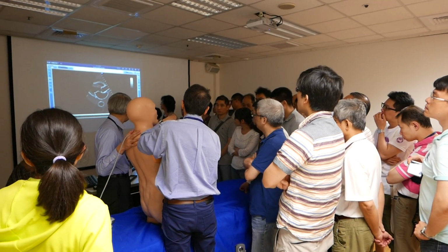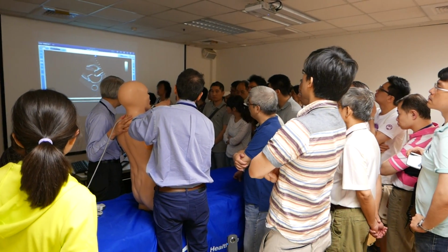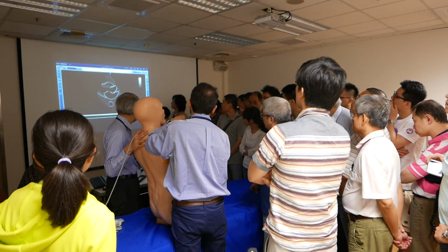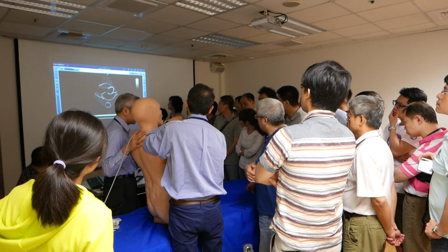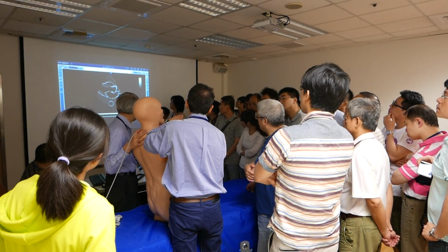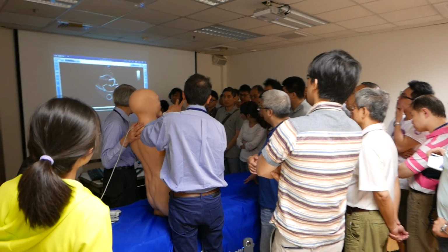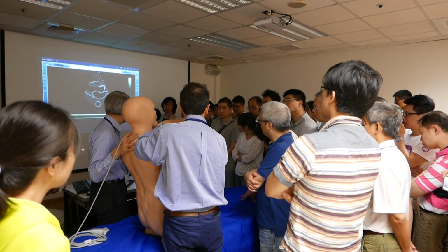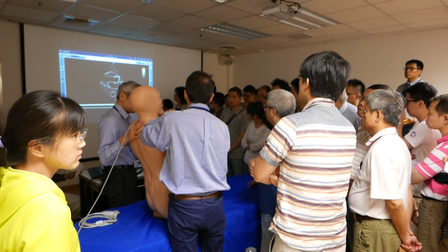By doing so, I've rotated my probe, and you see, I don't see the aortic valve anymore. So I have to correct, so we can see the aortic valve again. So it's not so easy to achieve the three things at the same time. So you will have to practice. Don't get frustrated. It is very important to learn how to do that.